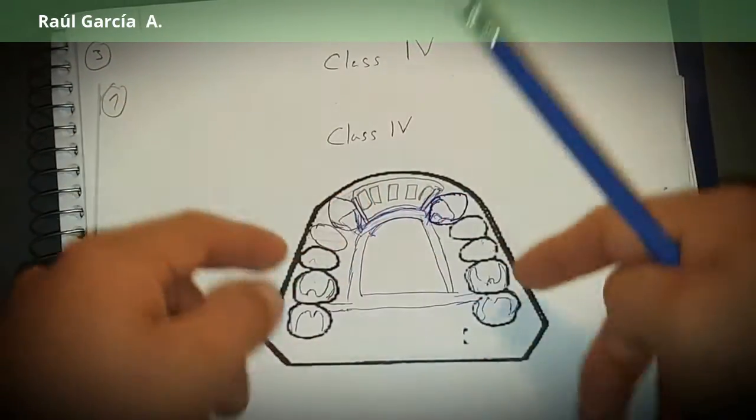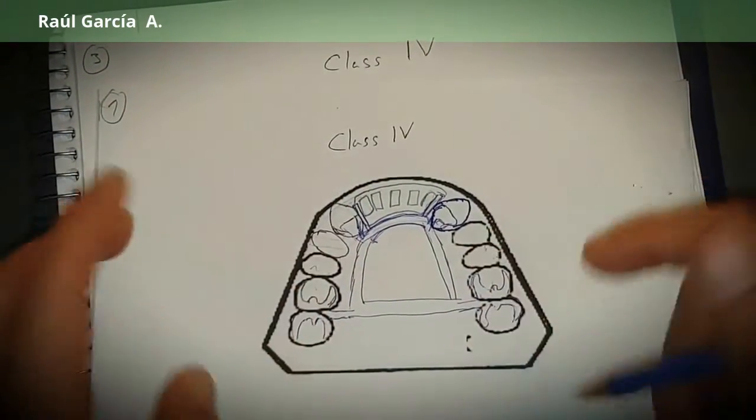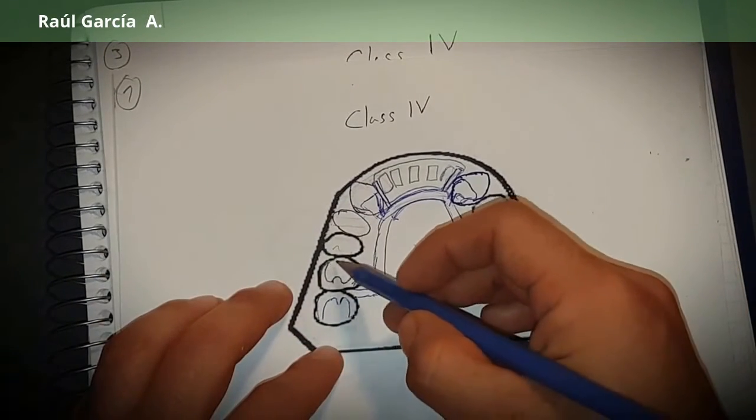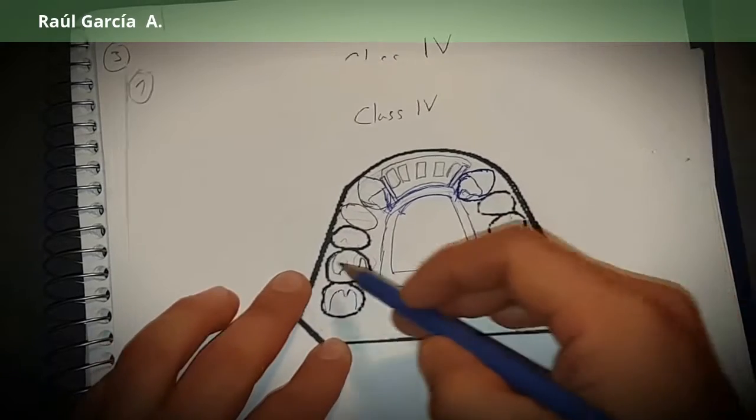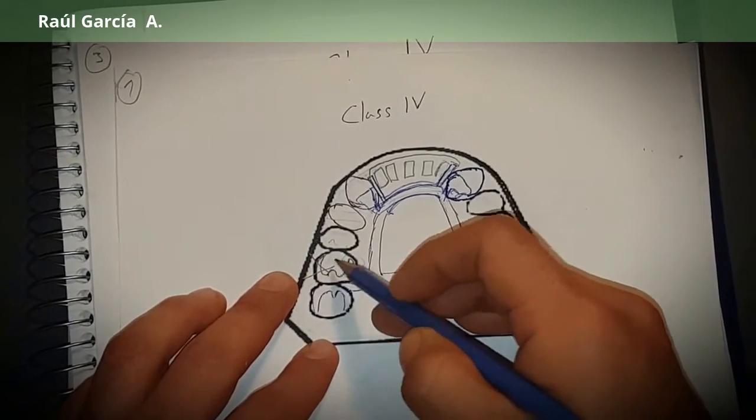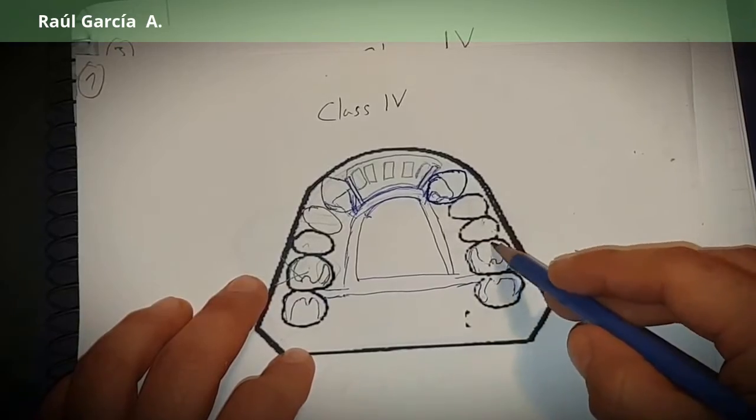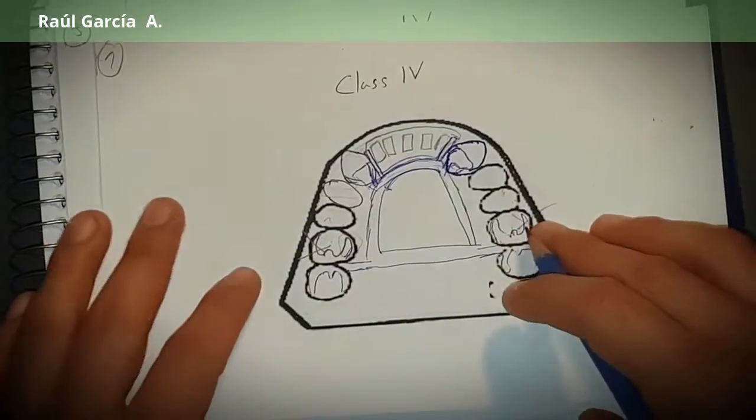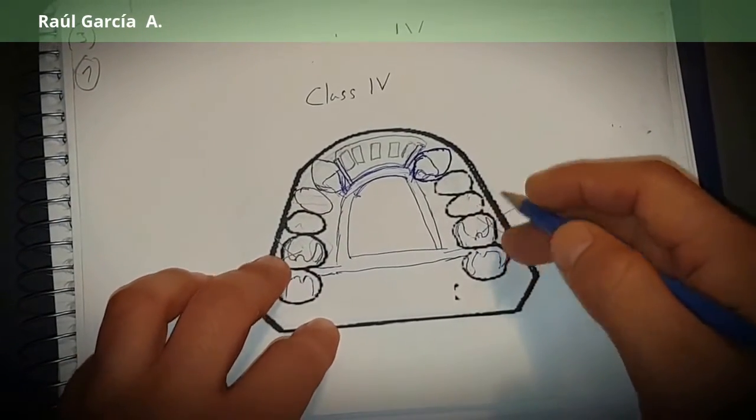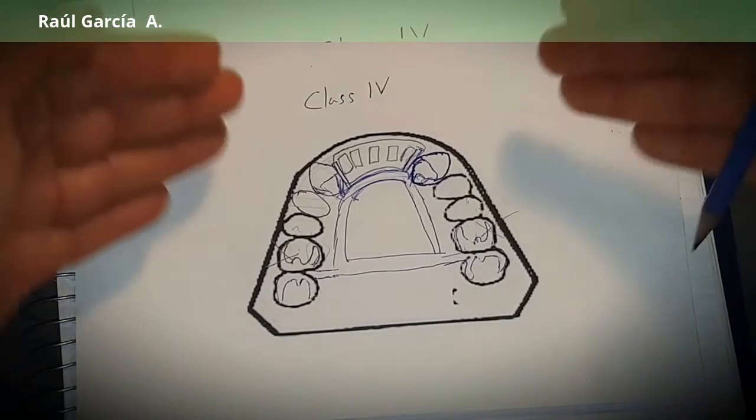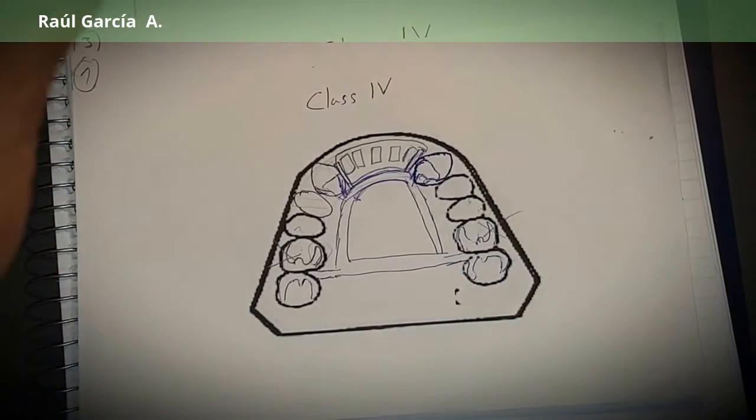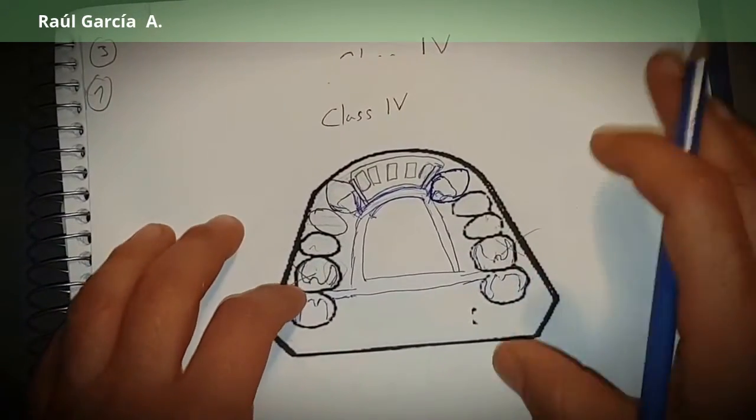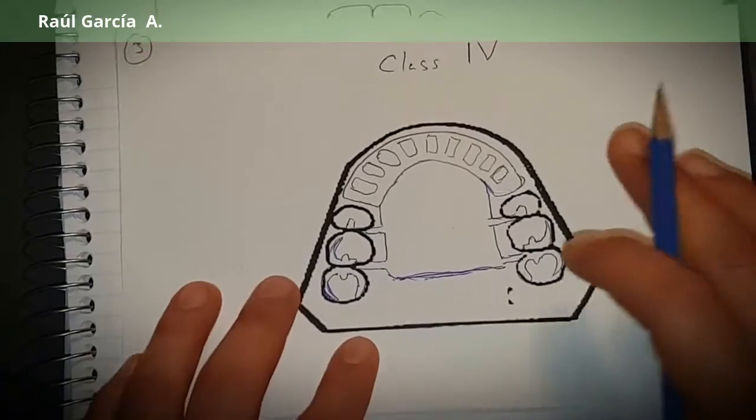You will find also in the books saying you can just use the reciprocating arms and just not draw the retentive arms here. Or you can draw them and just put them on top of the survey line, so it means it doesn't go into an undercut. They're just there to help stabilize the RPD.